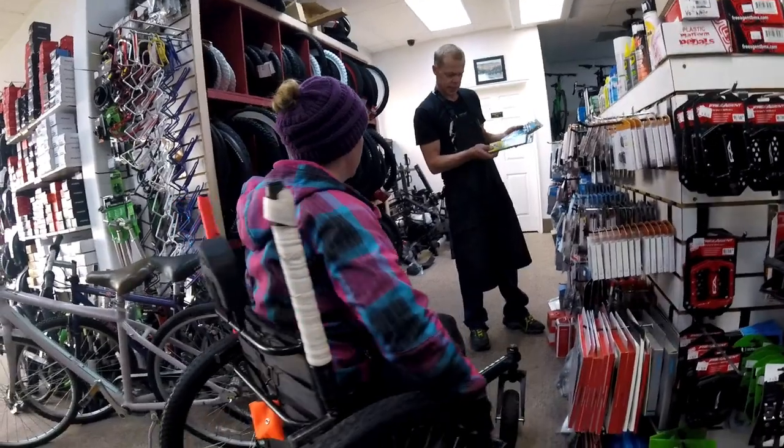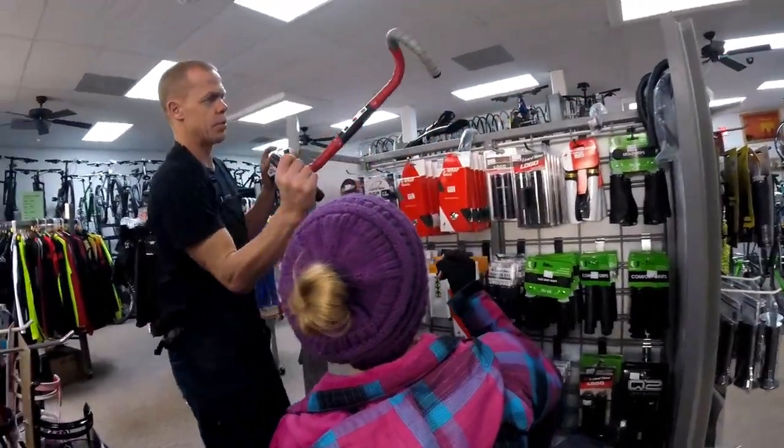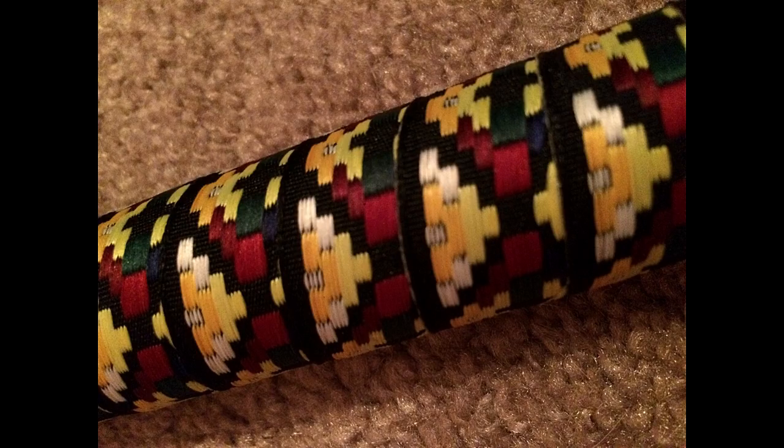Once I decided on what tires I wanted, it was time to talk grip tape. I also ended up with an extra set of levers for my Freedom Chair, but the wrap tape on them was mismatched. For the new wrap tape, I wanted something fun and different than what I'd had in the past, but also sturdy. Brian made a couple of recommendations and even showed me how they felt wrapped on handlebars. Ultimately, I decided on a random and fun southwestern-style woven tape, and I couldn't be happier with the upgrade.